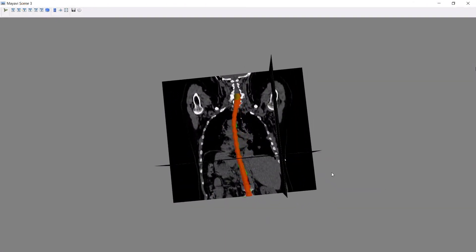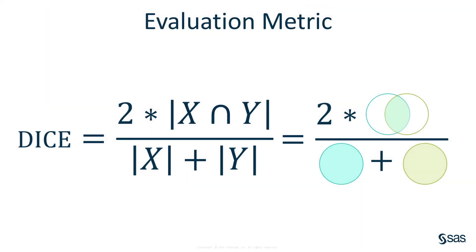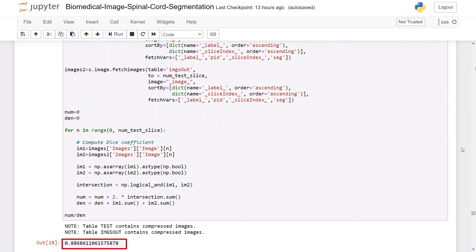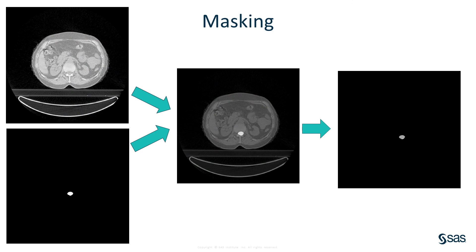Here, the predicted spinal cord region is shown in red and the ground truth region is displayed in green. The evaluation metric I'll be using is the DICE score. If X is the ground truth and Y is the predicted segmentation region, DICE is defined as 2 times the intersection of X and Y, all over X plus Y. A perfect DICE score is 100% and a completely imperfect DICE score is 0%. The current state-of-the-art DICE score for spinal cord image segmentation is around 95%. The DICE score for the test set predicted by this model is 89%.